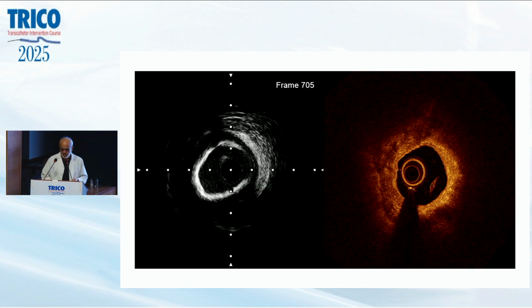Now this has been an investigator initiated study at our place, IOPUS, and I am showing a few images. In 72 cases we have done simultaneous images of IVUS and OCT in the same patient, and you can see IVUS. You can see definitely this is a horseshoe calcium.